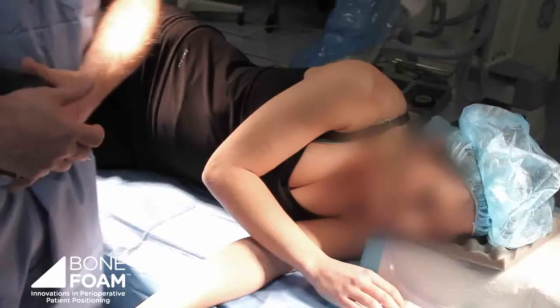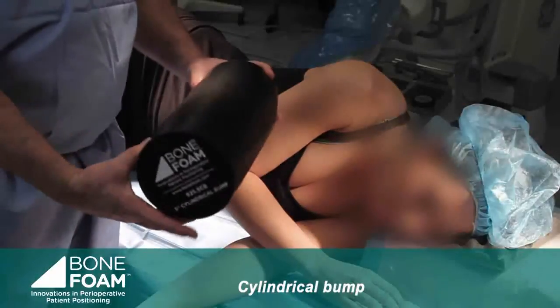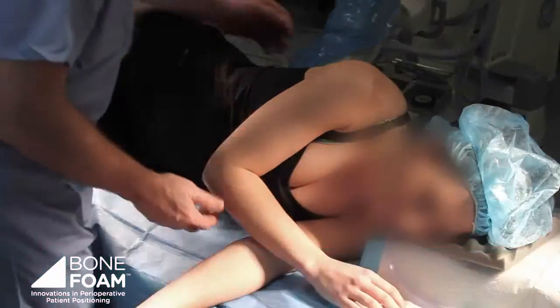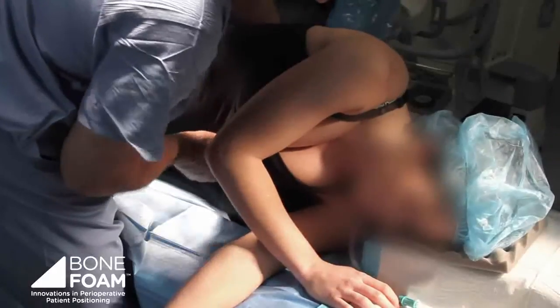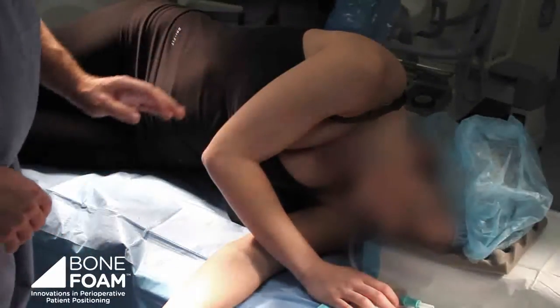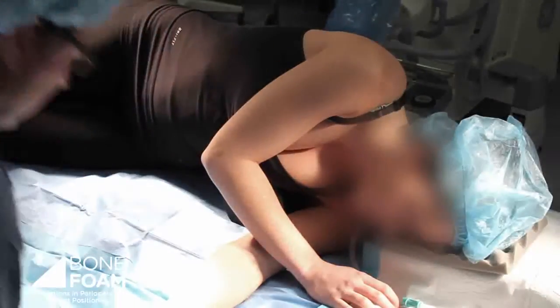The axillary bump doesn't work with the upper extremity wedges, so we use this small cylinder for that purpose. So I'm going to scoot the patient up like so. This will rest right under her latissimus, leaving the axilla free of any pressure. The next thing I want to do is create a platform for the upper extremity wedge positioner.